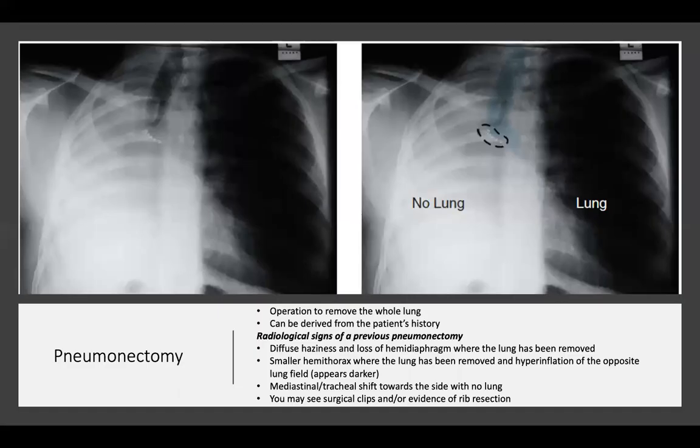That was an example of a radiograph showing pneumonectomy — an operation to remove a whole lung. Radiologic signs include diffuse haziness and loss of hemidiaphragm on the removed side, smaller hemithorax on the removed side, hyperinflation of the opposite lung field appearing darker, and mediastinal or tracheal shift towards the side with no lung. You may also see surgical clips or evidence of rib resection. Note that you cannot differentiate between a pneumonectomy and a complete lung collapse on a chest radiograph, as they both look the same.